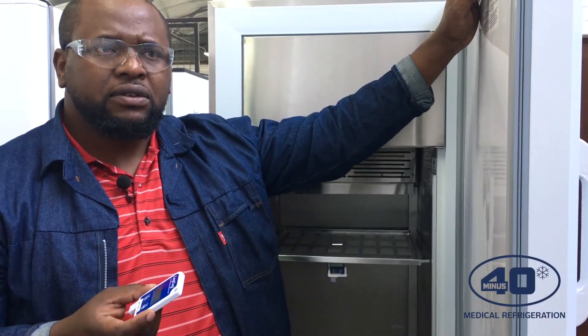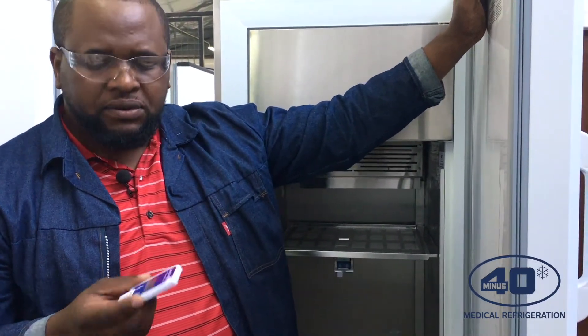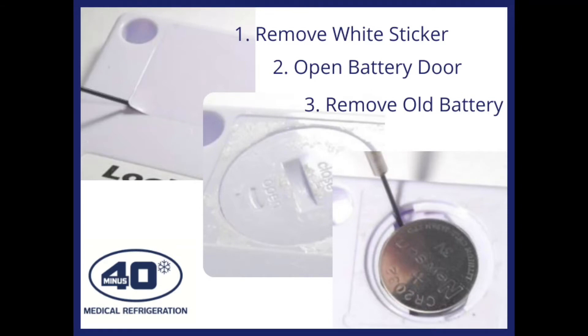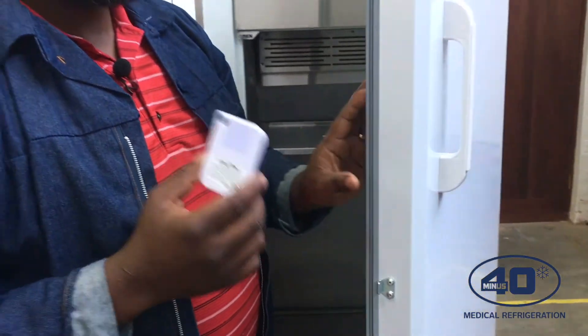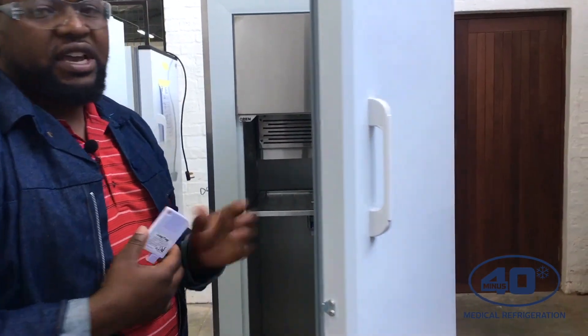Regarding battery replacement: the battery can last over a year. To replace it, go to the back of the device, remove the clip at the back, and use a coin to turn the clip inside so you can replace the battery. After replacing the battery, it is recommended to send the device to a SANAS-accredited lab for calibration, to ensure you continue to get accurate readings.